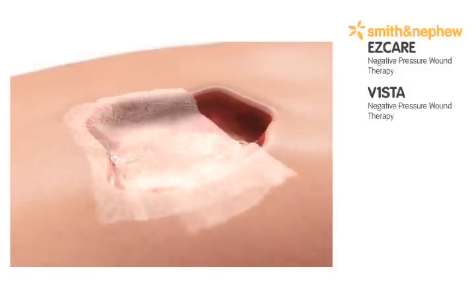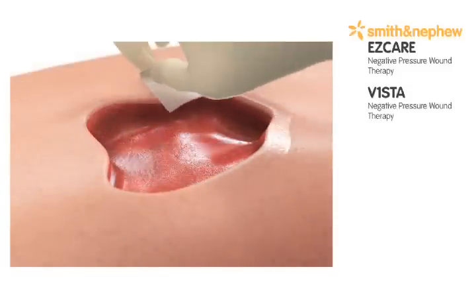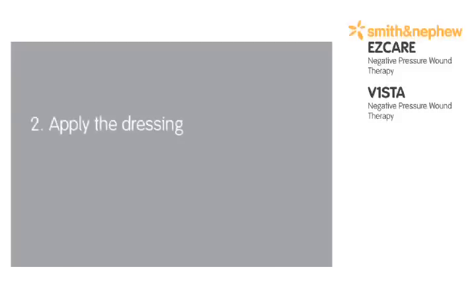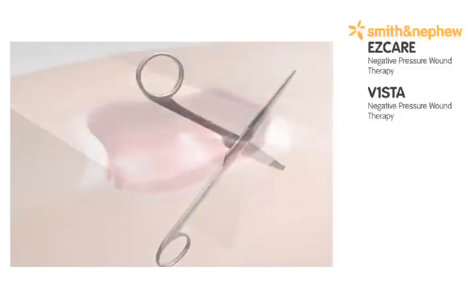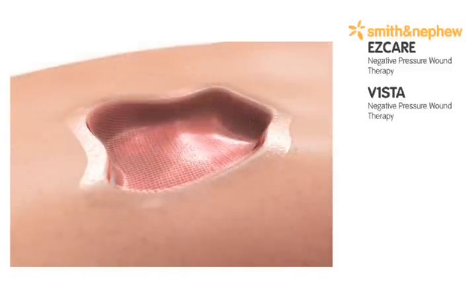Clean the wound bed and pat dry. Apply skin prep to the peri-wound area. Cut a single layer of non-adherent gauze to match the wound bed and lay the gauze across the wound bed.